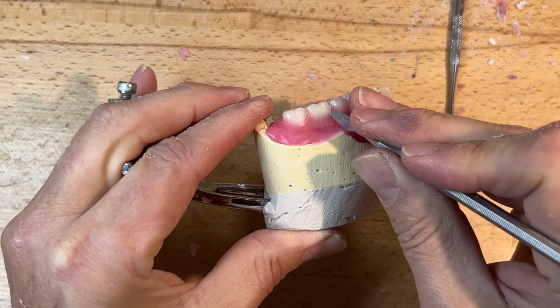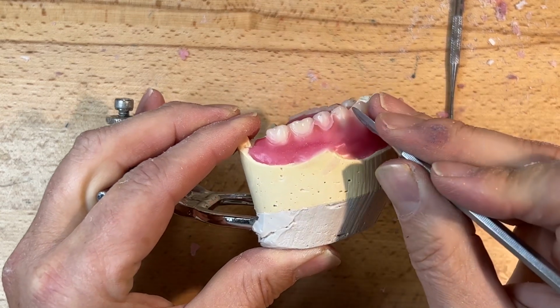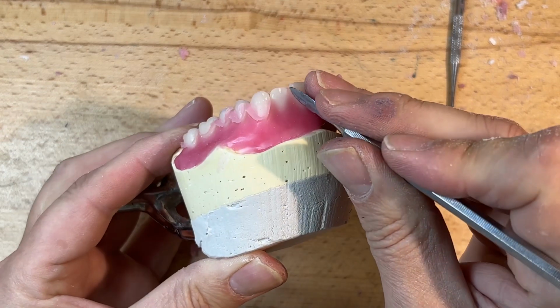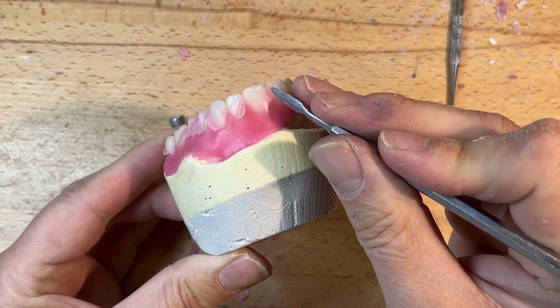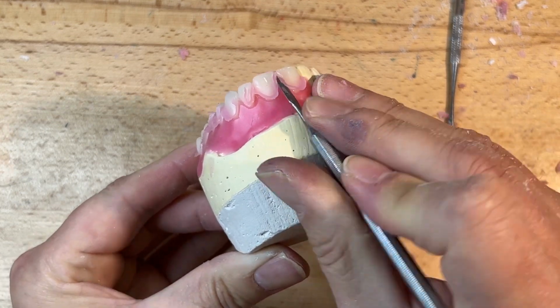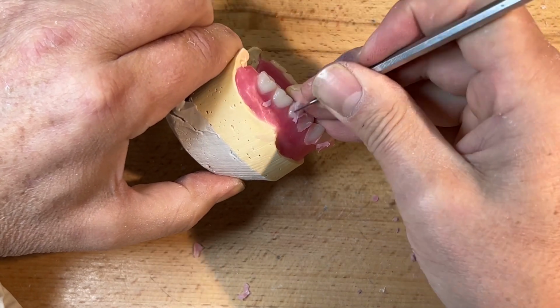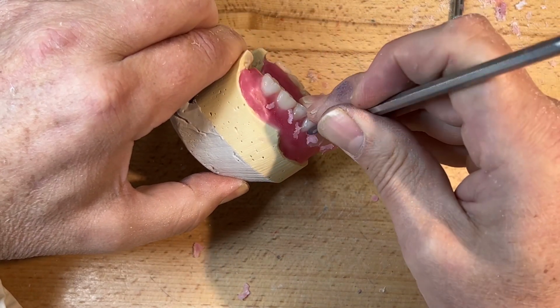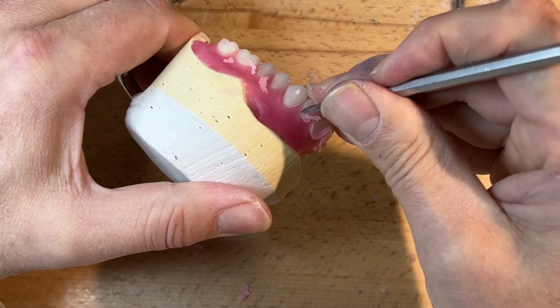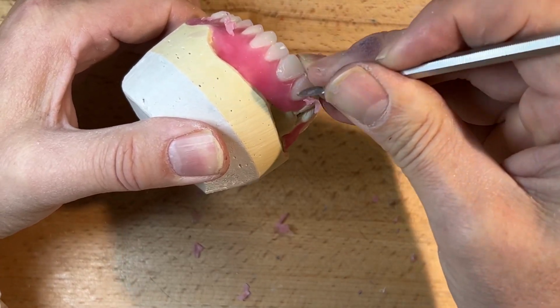And I'm right-handed, so I'm always going right to left. I'm not going left to right. You want to start at the central, you go ahead. You want to start at the 7, you go ahead. Wherever you wish. But I'm not taking it in one fell swoop. I don't want any peeling of this wax. I think that's a good preliminary start. I'll go back and I'll take off what I've removed. And then I'm going to refine that a second, a third, a fourth time to get to the right length. This is a little bit premature on the length.